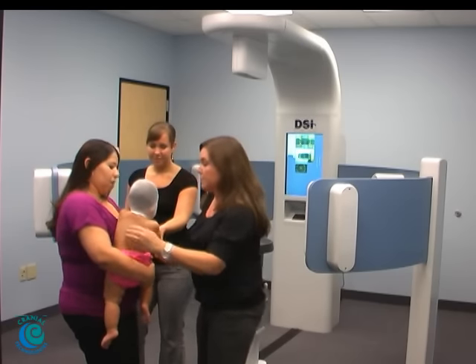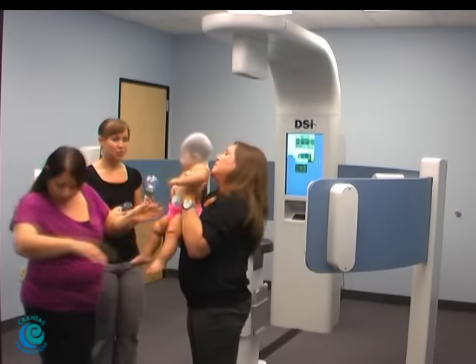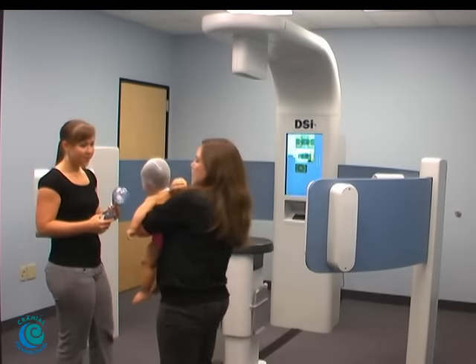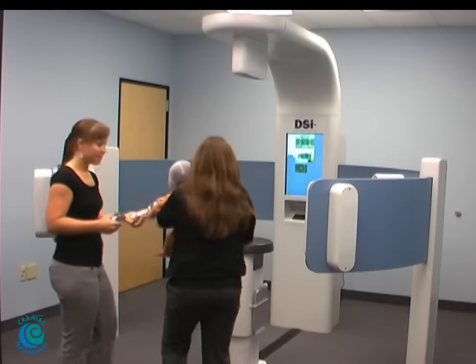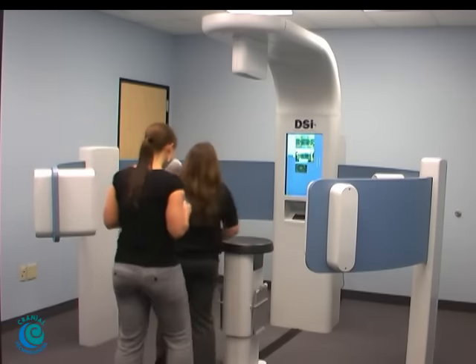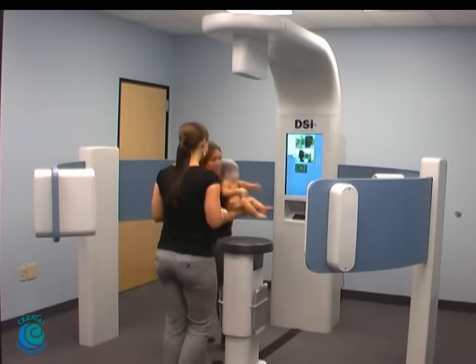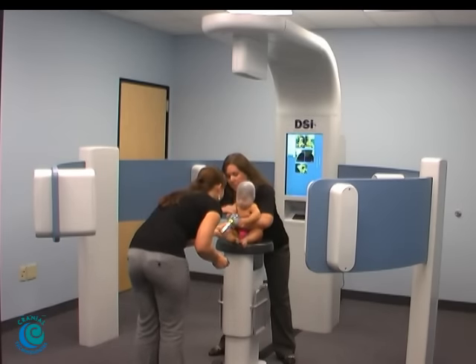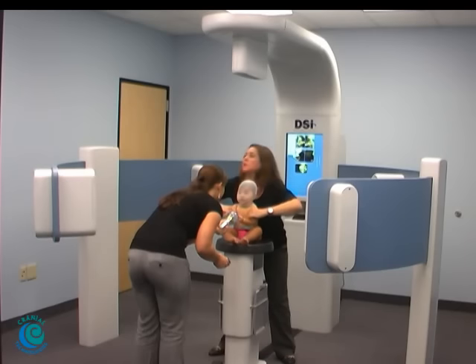All right, so I'm going to take her from you. You guys can have a seat right there. I'm going to be sitting on the stool, and we're going to have her sit up nice and straight, and Brianna's going to have her look straight at her so that we get a good position in her neck and everything.